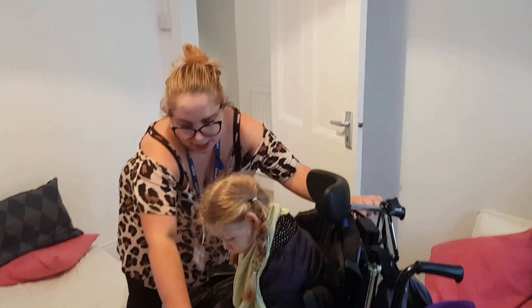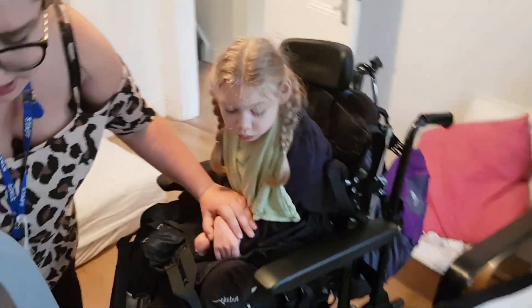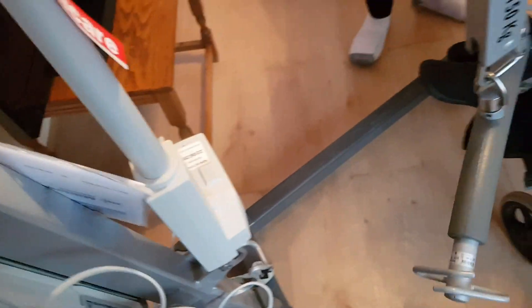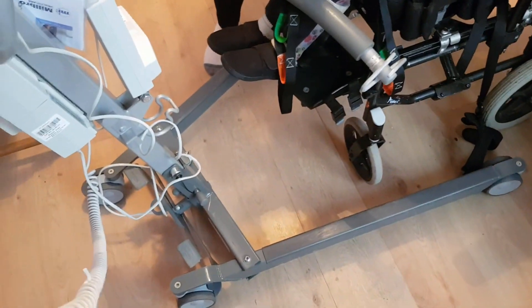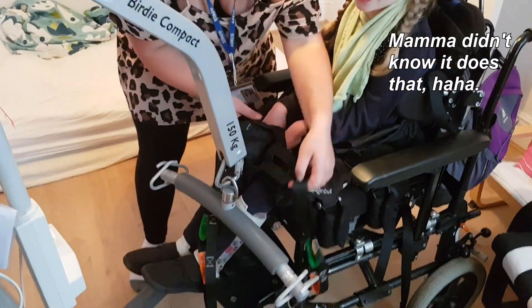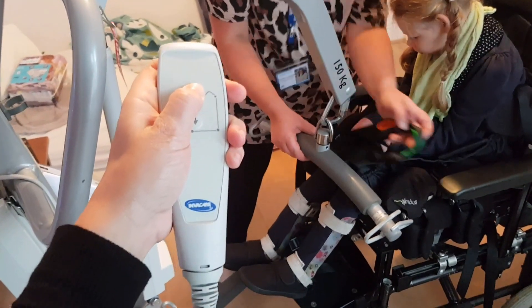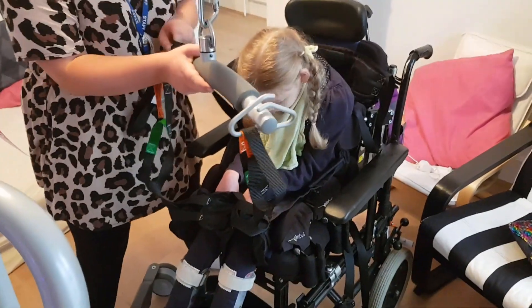I have the control. Move the wheelchair — if you push this lever down here, that will bring the legs out. The legs have gone out, which means they fit around the wheelchair. Mommy's gonna press the up button to make this a bit higher. I am pressing and it is moving. We'll try the orange straps and the shoulder straps.